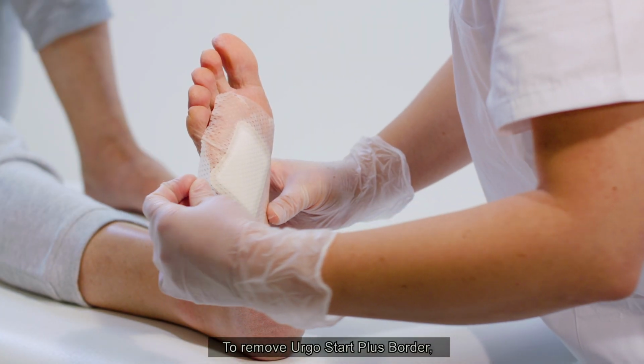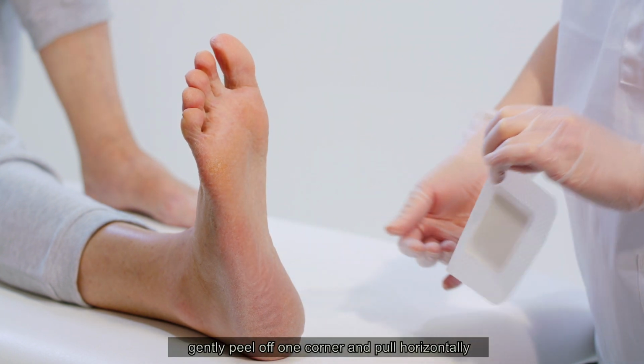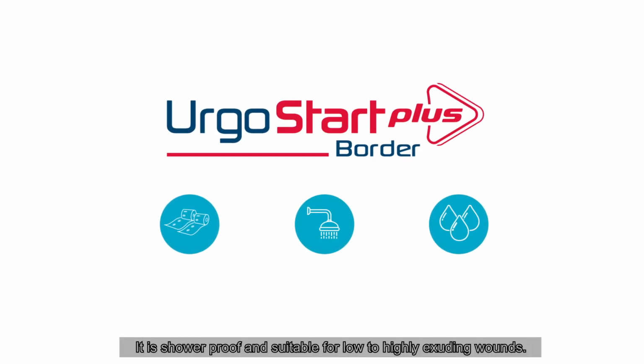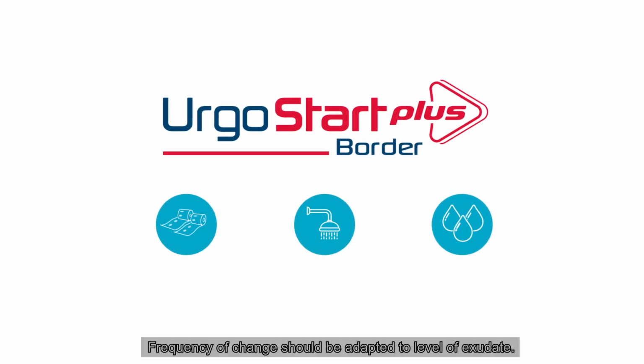To remove UrgoStart Plus Border, gently peel off one corner and pull horizontally. UrgoStart Plus Border can be used under compression. It is shower-proof and suitable for low to highly exuding wounds. Frequency of change should be adapted to the level of exudate.